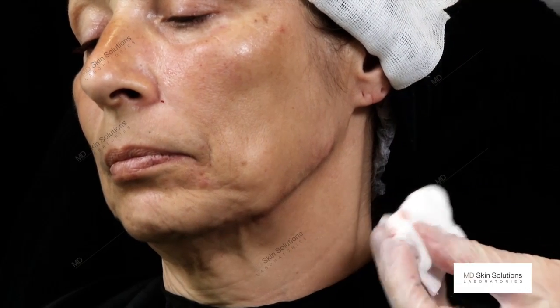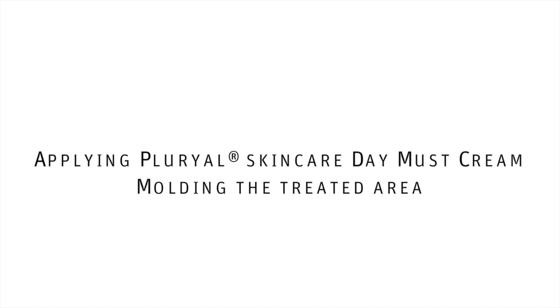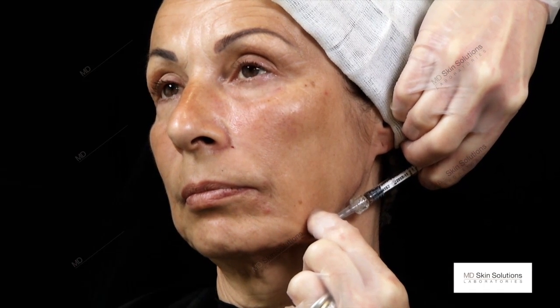What we do now is we mold the filler with the Pluryal Day Cream. Subdermal placement, a little thread here, pinch eventually in order to hold the filler in between your fingers, and then we're done.